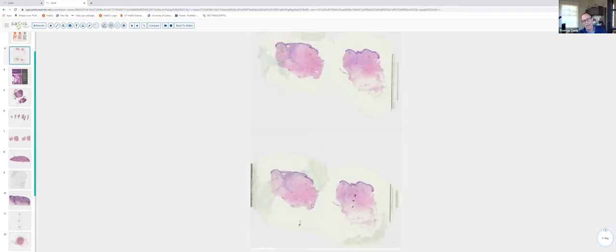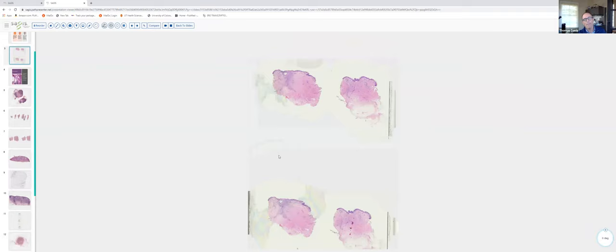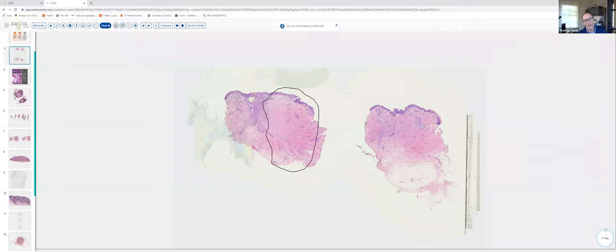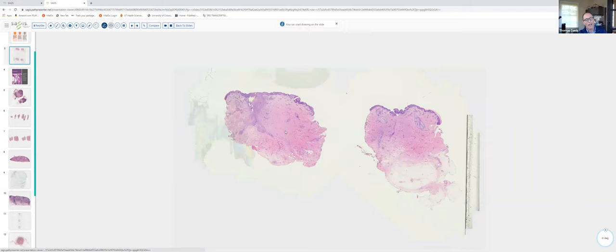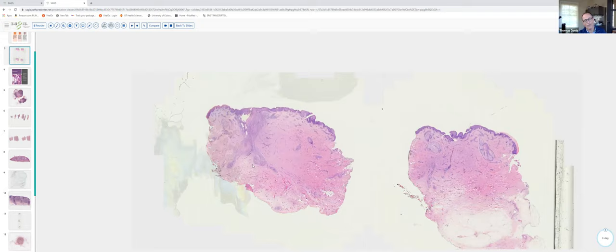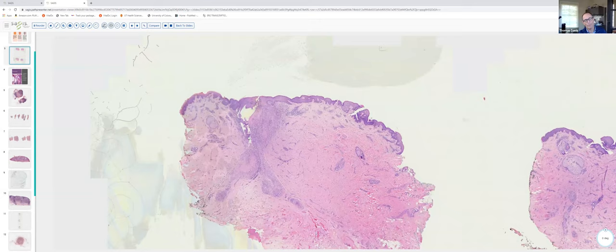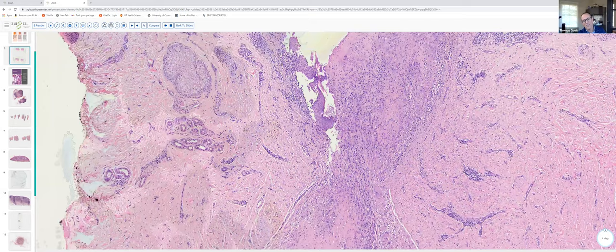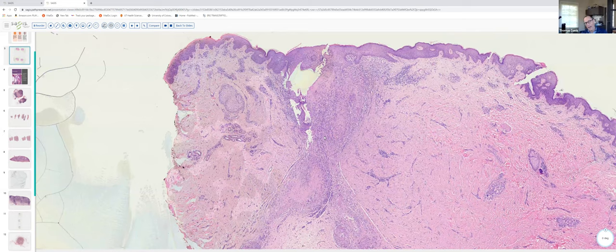Our first slide was a bisected punch biopsy. Readily apparent is fairly extensive dermal fibrosis. Looking at the left and right pieces of tissue, there's a little bit of dermal fibrosis with absence of adnexal structures. On scan, I noticed a zone of fibrosis and also a vertically oriented perifollicular infiltrate centered around a disrupted hair follicle with disrupted follicular epithelium and granulomatous inflammation.